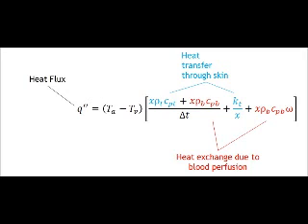Now, if I'm going to be entirely honest, most of the things here are constants. The only thing that's really going to matter is the small delta T, which is the time in which the probe is held to the hand, which is going to be about 30 seconds. We kind of remain that as a constant, and the omega value. Omega is the blood perfusion. That's the thing we're trying to find.